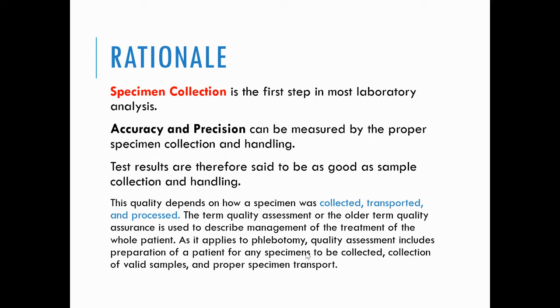That is why in every collection of specimen we do, we need to be very careful first. We need to be accurate in the things that we are doing so that it will give us the best results and the patient will be able to receive the best treatment or the best diagnosis for them.